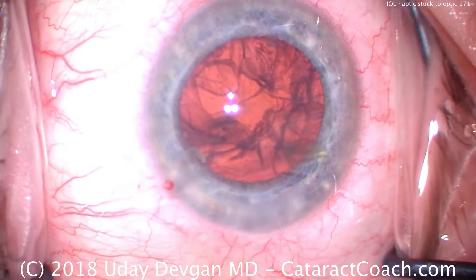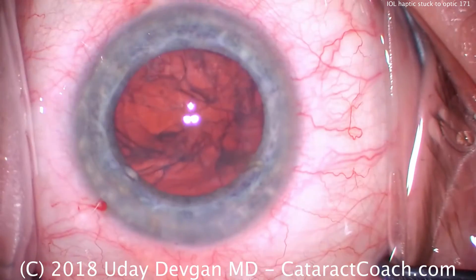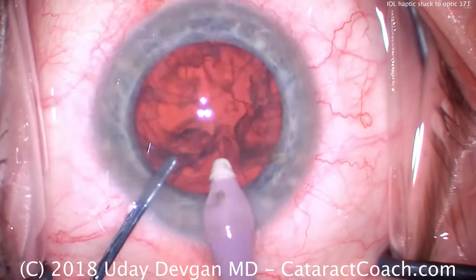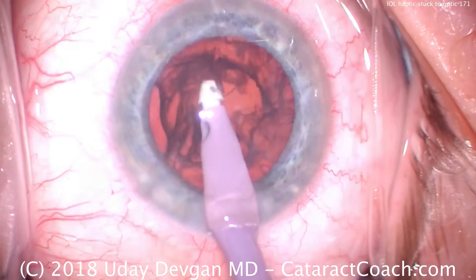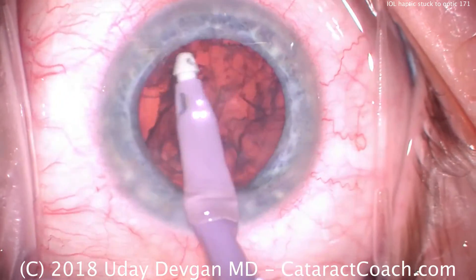Then time for our cortex removal. For the lens choice here, we are using a single-piece acrylic monofocal lens — it's a hydrophobic acrylic — and it's one of these preloaded lenses. Preloaded means the technician puts the viscoelastic inside the injector and the lens is already inside the injector, but it does require a little bit of preparation ahead of time.